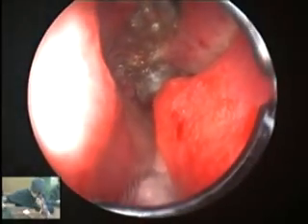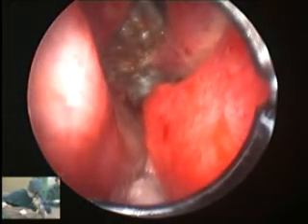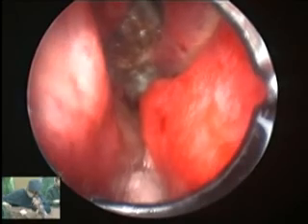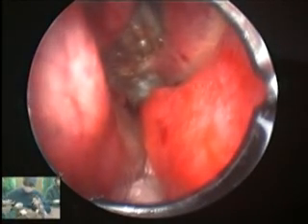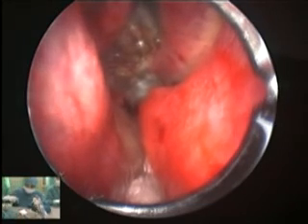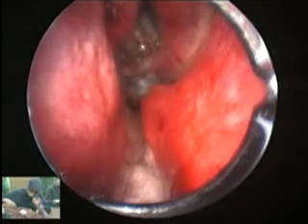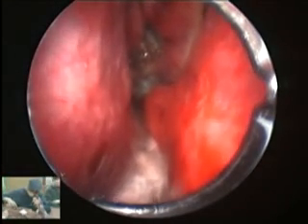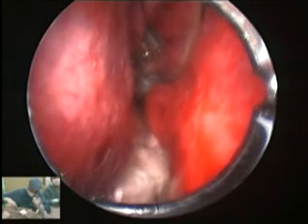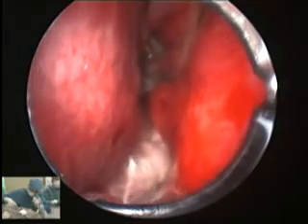So I would like to take down this spur before we start. Sham, would you just like to tell us how you have prepared the nose before we have joined you? I've put in ribbon gauze, soaked in 5% cocaine with 1 in 10,000 adrenaline, 6 mils altogether into 6 ribbon gauzes.